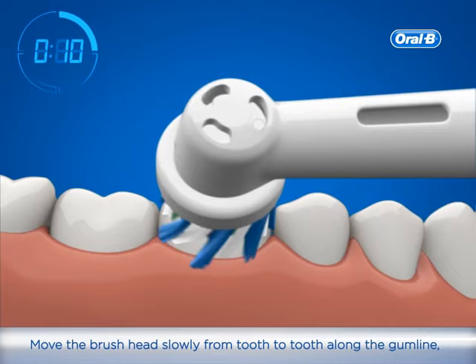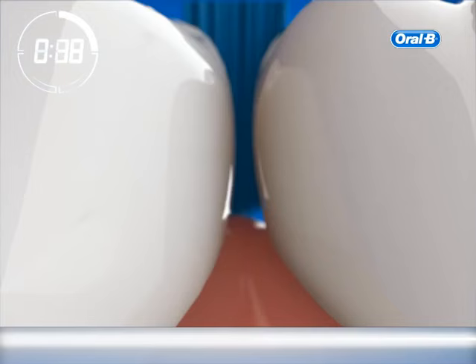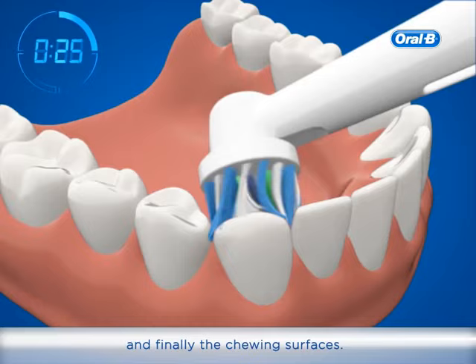Move along the gum line, spending a few seconds on each tooth surface. Brush the gums as well as the teeth. First, the outsides — incline the brush head so the bristles can reach interdental areas. Then the insides.